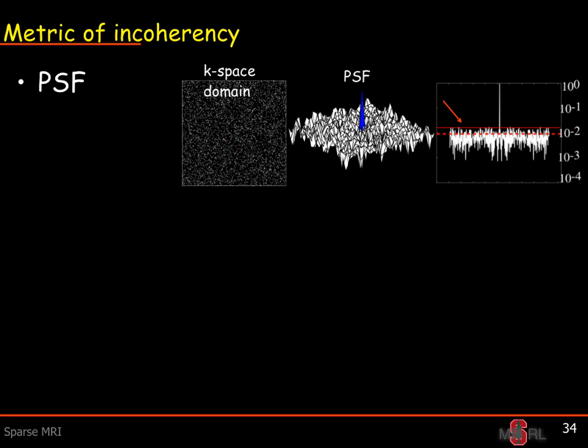We can look at the goodness of this pattern by looking at both the maximum side lobe amplitude, taking a profile across one direction of this pattern, and the RMS amplitude of the aliases. One thing to note is that this is essentially equivalent to taking a delta function in image space, calculating its forward Fourier transform, undersampling it with this pattern, and then going back to image space and looking at the aliasing pattern you got.